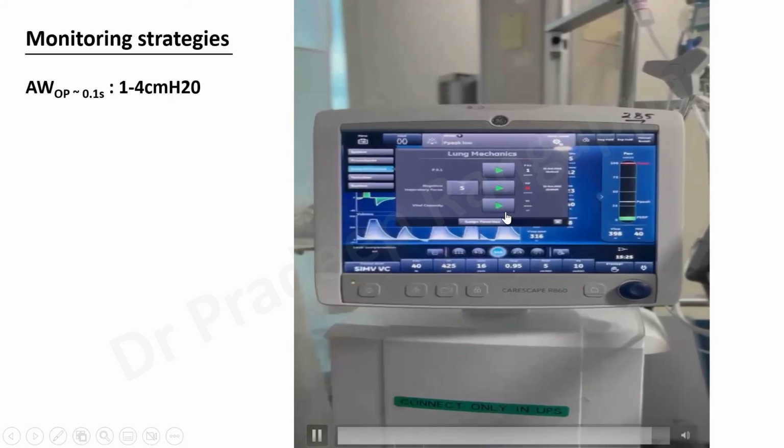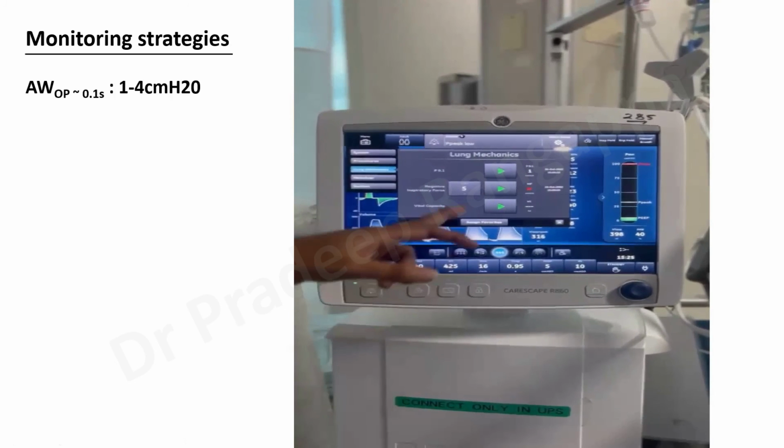So for this patient, the respiratory drive was 1, which was normal. If it is less than 1, then you should be worried. Then you have to change the trigger to improve his inspiratory effort, because less than 1 means there is a lot of stress on the lung. If it is more than 4 also, there is stress on the lung. That's what we look at. So when the stress increases, your transpulmonary driving pressure goes up, and your driving pressure and transpulmonary pressure have a bearing on your lung injury.